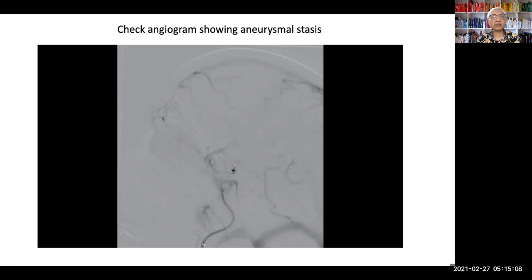It was necessary for the segment just above the neck because whenever we put pressure on the flow diverter, it tends to bulge more into the neck of the aneurysm rather than onto the wall of the aneurysm. And that's the summary of this case. I think we got some great products on board, and we are very, very happy with both the Surpass Evolve and the Synchro Support. And I believe these are the hardware that have come in the recent past, which allow us to succeed in cases which we normally would have given up.